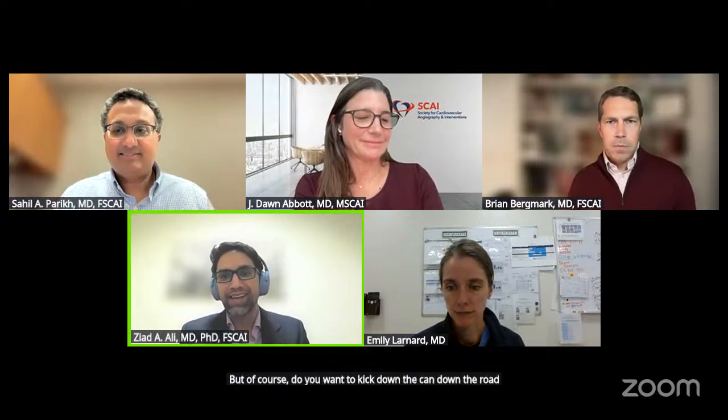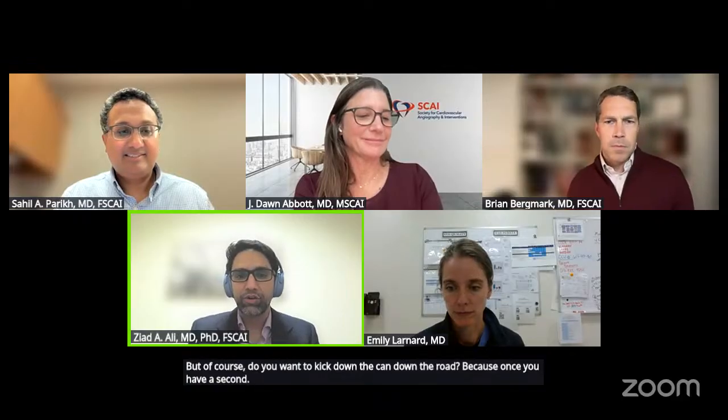Oh, thanks. Sorry. So I'm glad to be introducing Brian Bergmark, who's going to be talking to us about single layer ISR. I think single layer ISR is really the fork in the road because there's still some controversy about what the best possible treatment is. I think it's hard to argue with the data on drug-eluting stents, but of course, do you want to kick the can down the road? Because once you have a second layer DES failure, then of course the morbidity and mortality increases. So are we trying to be preventative cardiologists, Brian, by using DCBs? Let's see what he has to say.